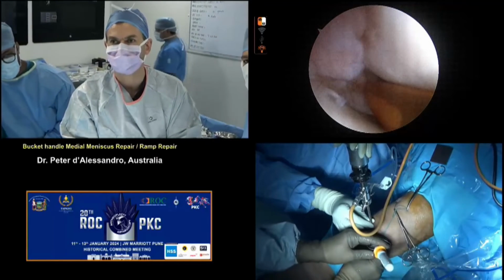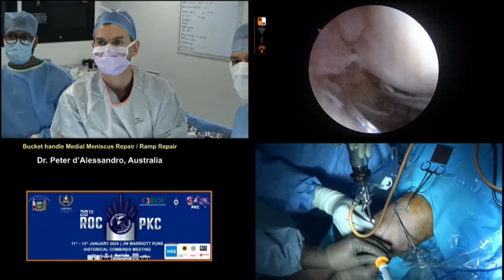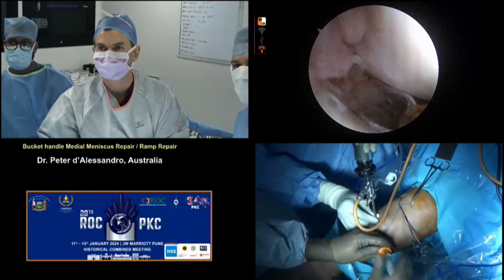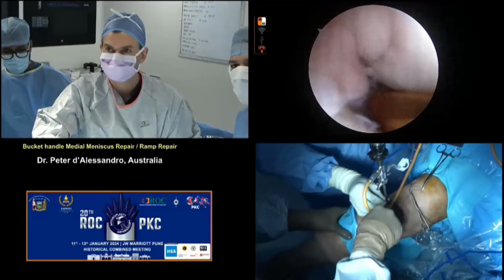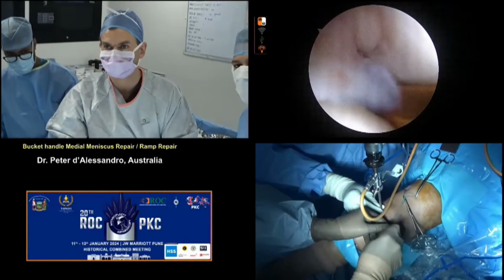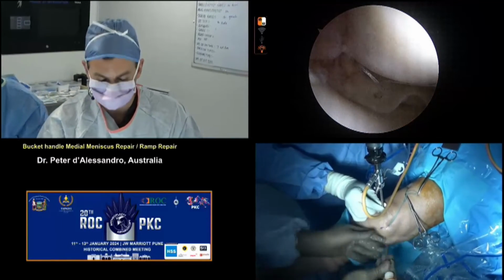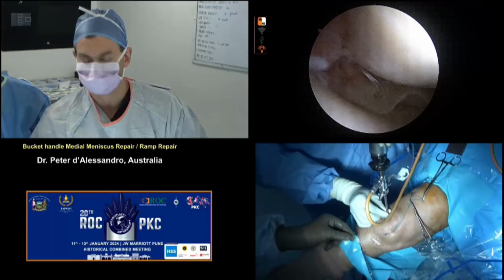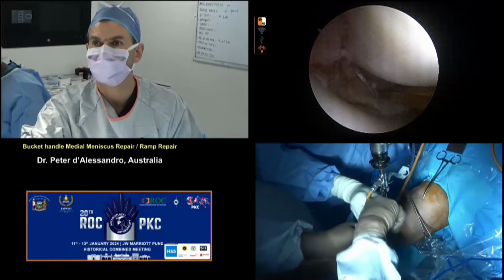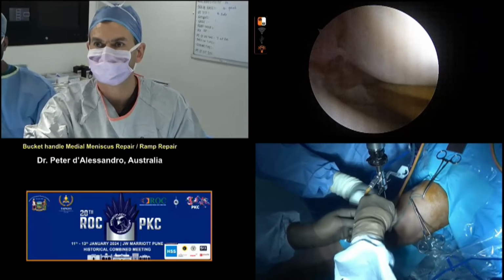Yeah, again, I think all very, very valid points. And certainly, I think the key is feeling comfortable that you've got sufficient visualization, and peeling off the capsule and actually doing exactly what you describe, I think is a great technique. Again, we've determined that wasn't required here, but certainly feel like that can be utilized if necessary.